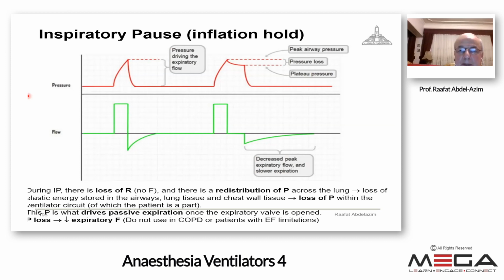I'm talking now about the ICU, but in anesthesia ventilators we usually don't ventilate patients for more than 24 hours, but we avoid giving 100% because of absorption atelectasis once we start anesthesia. Now we have used 60%, and we need more help.